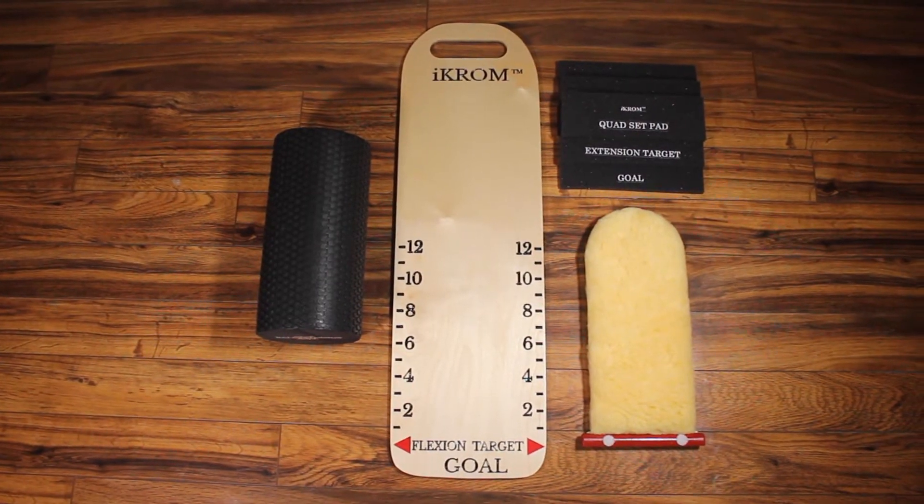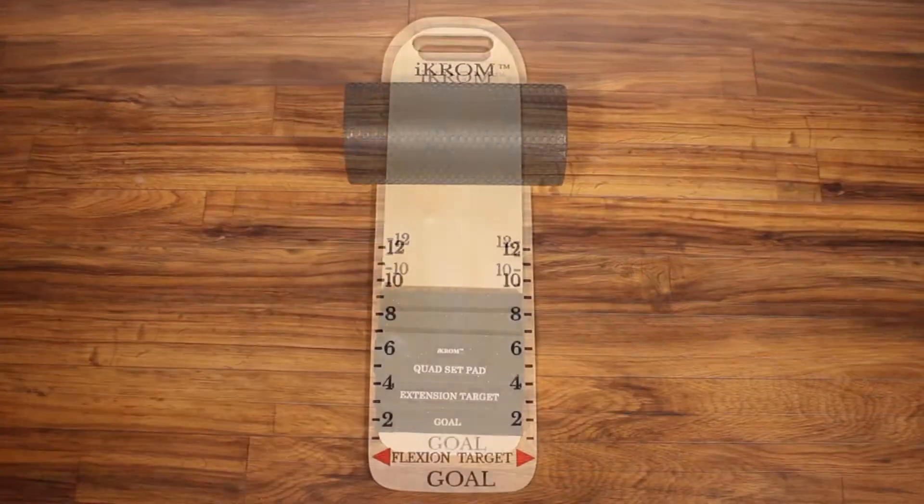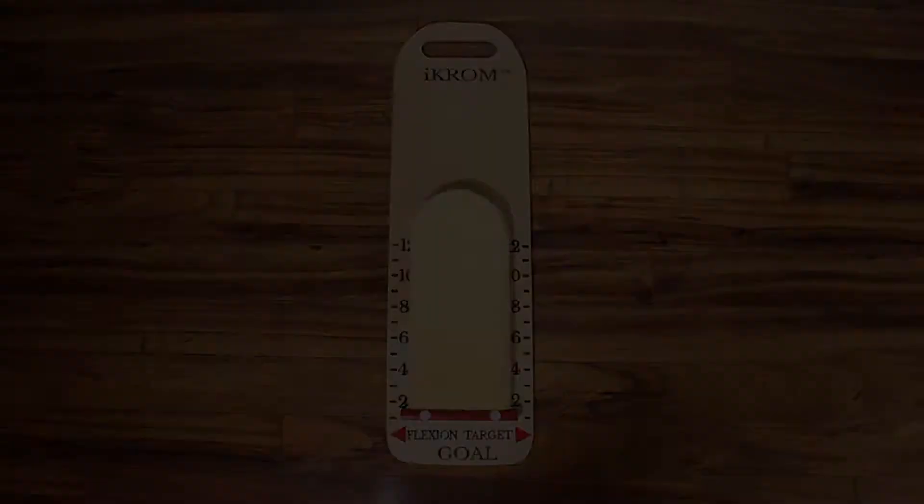Your Incentive Knee Range of Motion exercise kit is a tool that will help you achieve knee range of motion goals after undergoing knee replacement surgery.